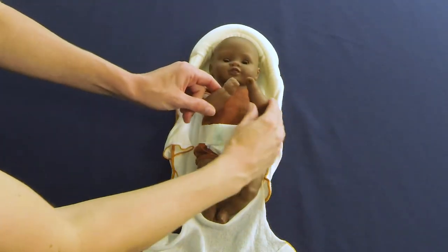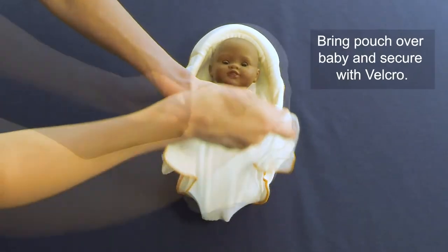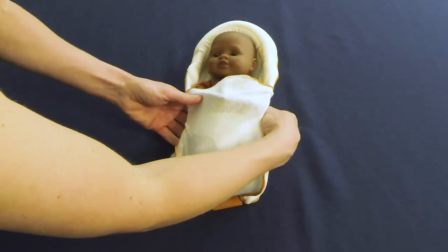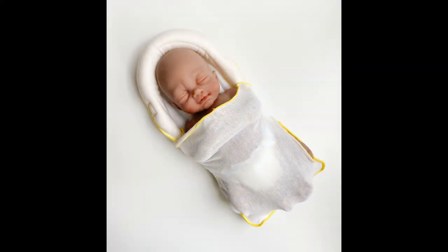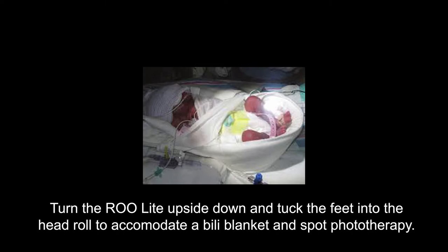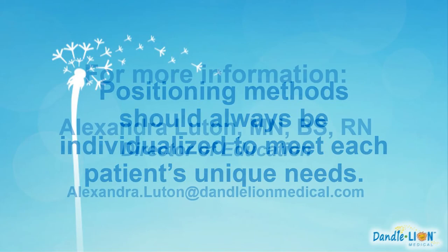Using the Rulite in this manner creates a cocoon-like sensation with 360 degrees of proprioceptive input, which is innately calming, while allowing up to 74% of phototherapy to penetrate to the skin. The Rulite can also be turned upside down to accommodate a phototherapy blanket beneath the baby while using the wings to contain the arms, exposing the baby to the phototherapy light overhead. As always, positioning should be adjusted to meet the individual medical and developmental needs of each baby.